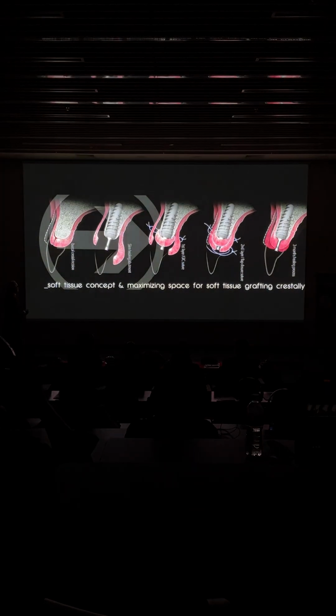So when we are going to increase the soft tissue vertically and horizontally, 99% of the dentists and surgeons that I know do the wrong incision. The more you want to improve your soft tissue vertically and horizontally, the incision should be as buccal as possible. 90% place it here. So by the time that you want to close it, this flap goes up and back, so it's impossible to close it. So every time you want to increase height, your incision is more buccally displaced.